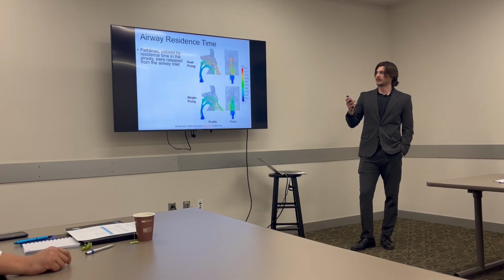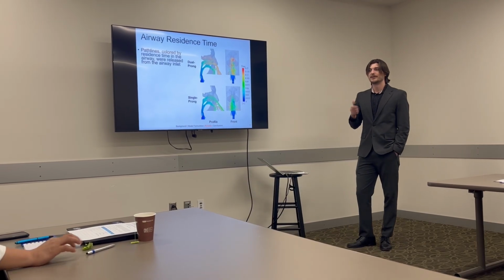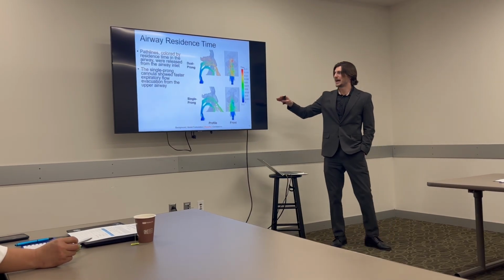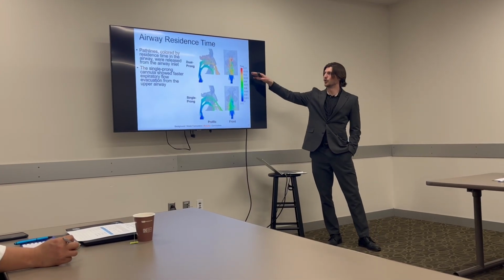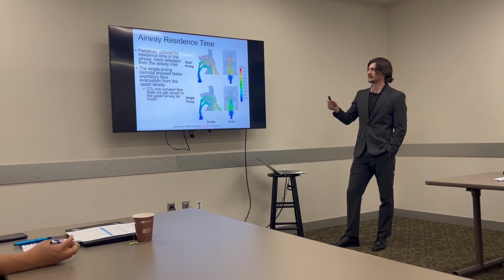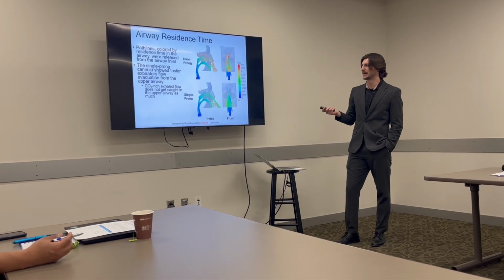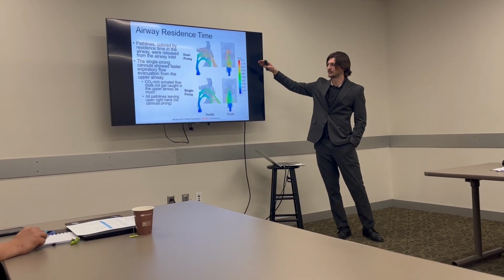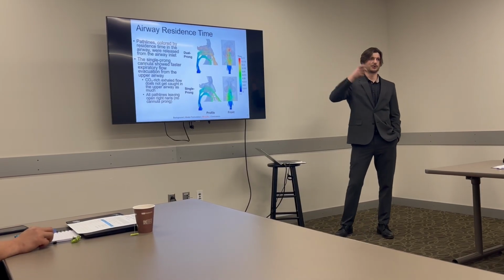We also released some path lines from the airway inlet colored by residence time. What these are showing is just how quickly the flow is able to escape the upper airway. As you see more red in the dual prong geometry up top, you can see that the CO2-rich expiratory flow is getting caught in those upper portions of the airway, as we've been discussing. For the single prong down low, we don't see as high residence times, and on the front view you can see all the path lines for the expiratory flow are leaving that open right nares.